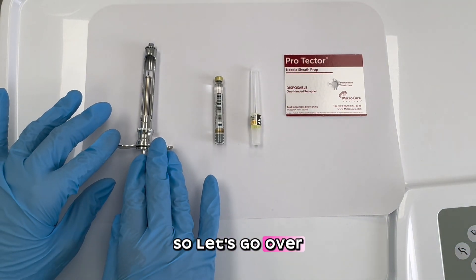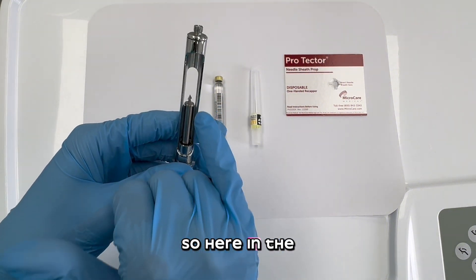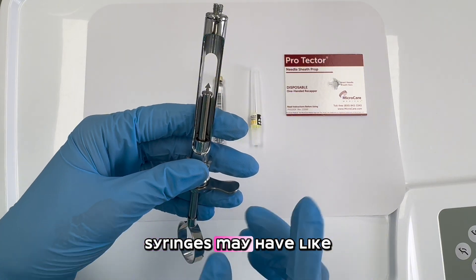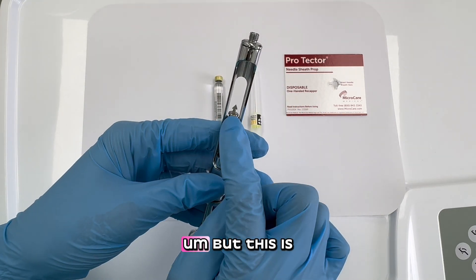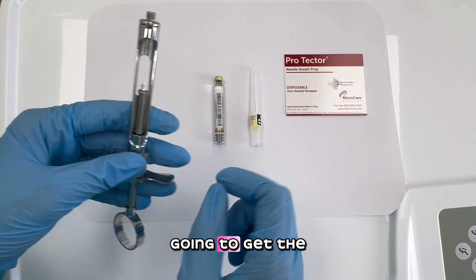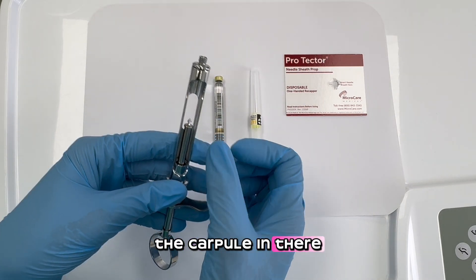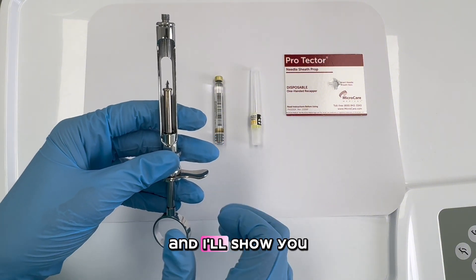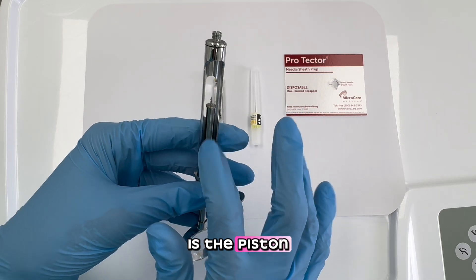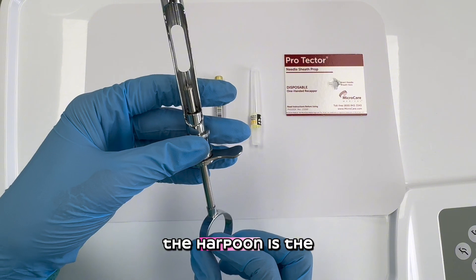Let's go over the components of the aspirating syringe. Here in the middle where you see that little arrow — other syringes may have a little hook — but this is very sharp. It's called the harpoon, and this is what's going to engage the carpule. I'll show you later on how that's done. And over here, this is the piston — the thing that goes up and down with the harpoon.